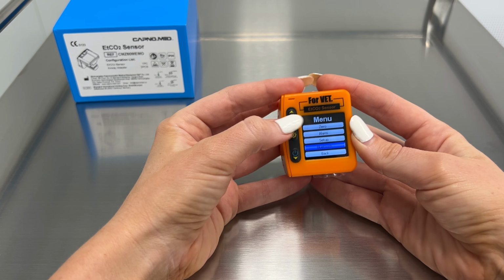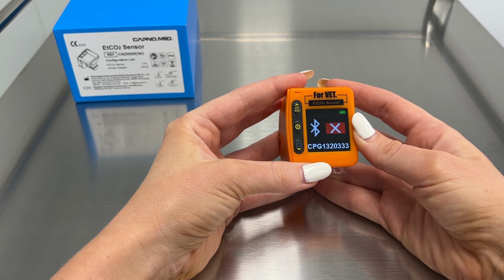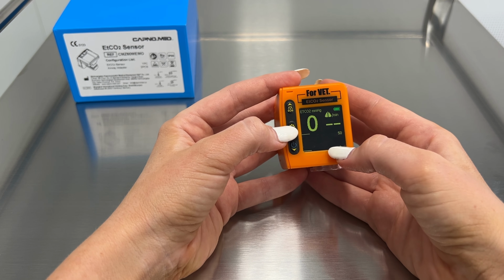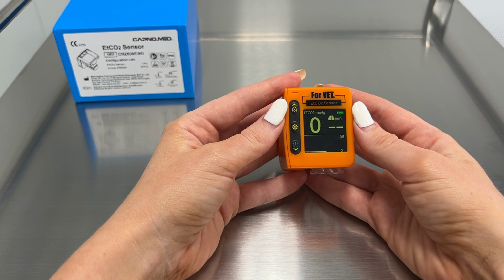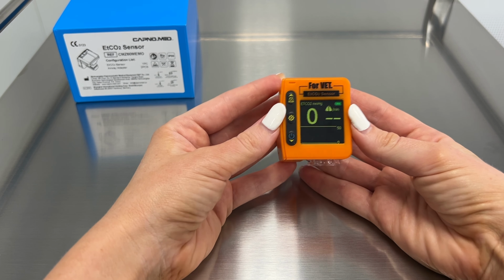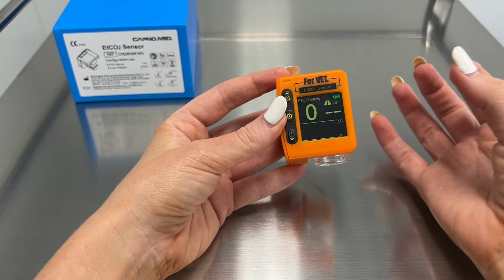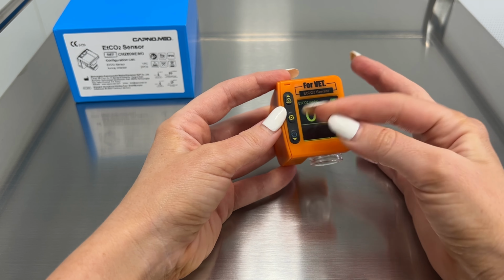If you wanted to Bluetooth your sensor, you would open your phone or your laptop and try and connect to that device. It times out and it's going to go back to our screen again. This little machine will indicate, like it will beep if you have a high parameter or a low parameter. It'll only be quite soft. You need to manually be monitoring this screen.